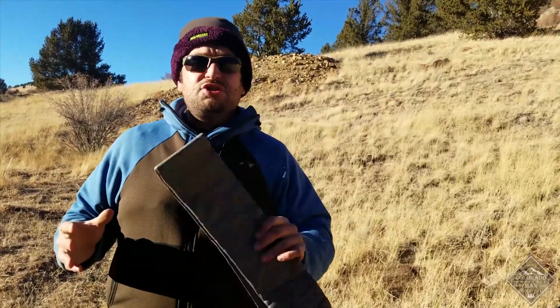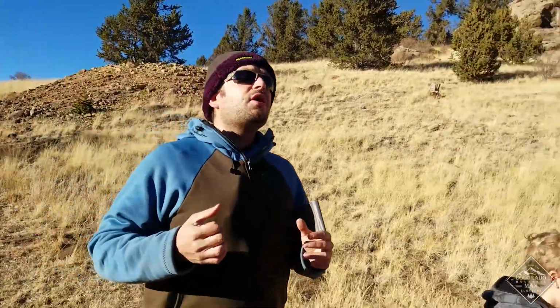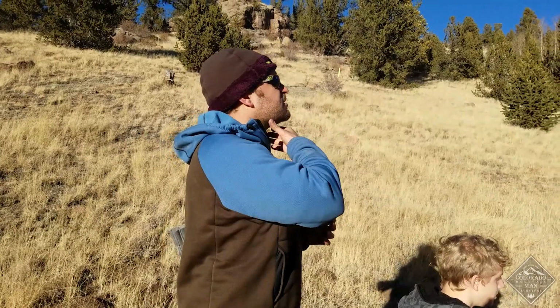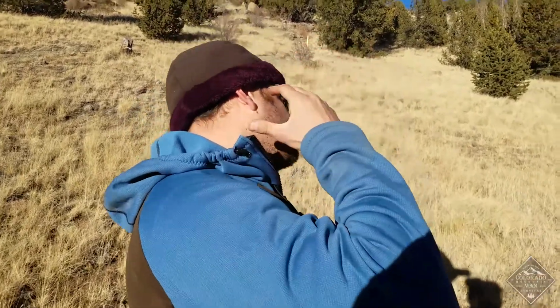I'm not going to talk a lot about how to do it or a lot of the techniques. I'm just going to show how to use the collar. Essentially, you want their head to be in line in the neutral position that's anatomically correct. So just like this. It's kind of an unusual position. We usually like to slouch our heads a little bit, but this is the best position they can be in. So you want to hold their head just like that. The jaw is kind of flat. Their head is not off to either side.